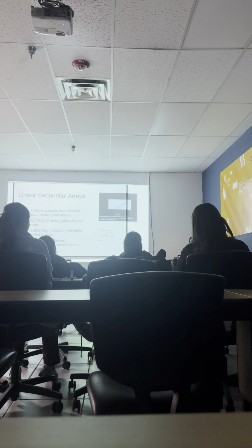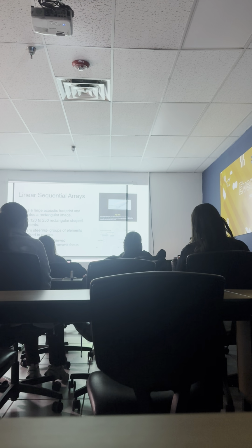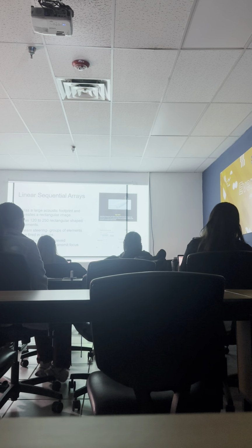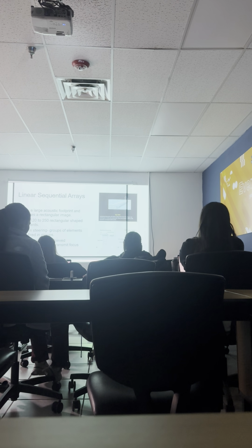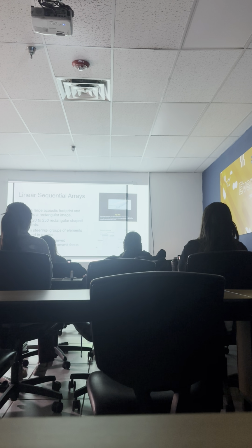Our machine could tell our probe to send out only 8 megahertz, and only listen for echoes of 8 megahertz. That's transmit focusing and receive focusing. It's not focusing for depth, it's focusing on the frequencies that are sent and received.